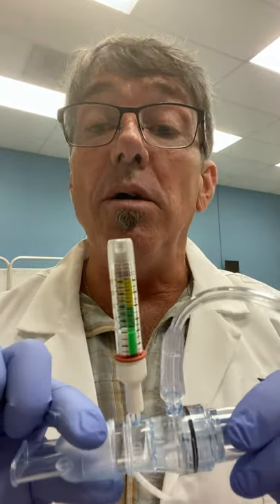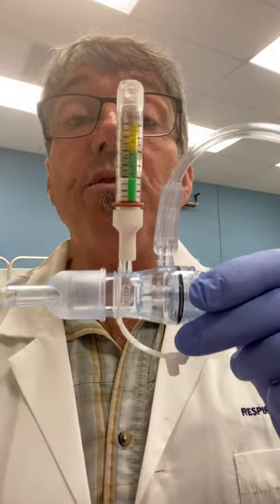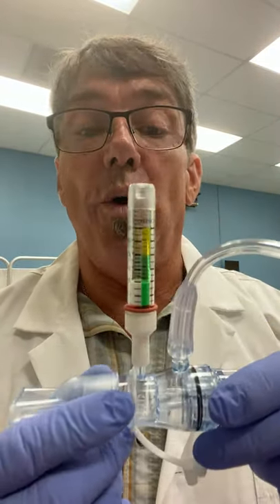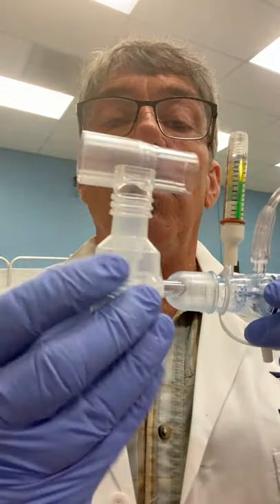The EZ-PAP can also be utilized with a small volume nebulizer so that you can be giving a patient medication through the small volume nebulizer at the same time, providing them back pressure or PEP therapy along with it. Let me go ahead and bring in a small volume nebulizer here.